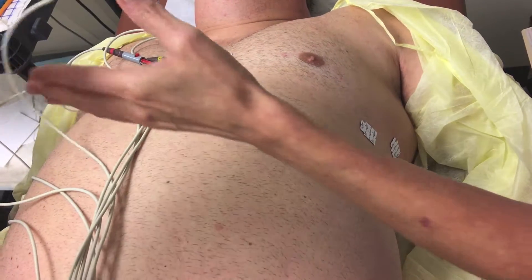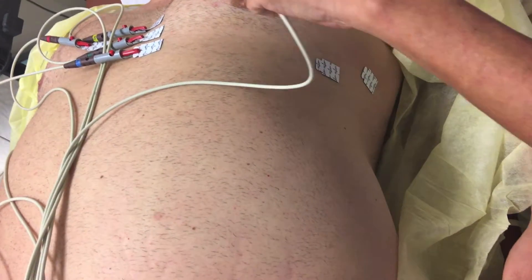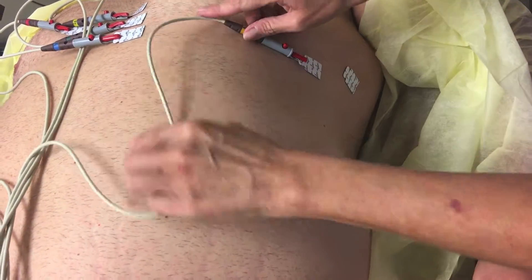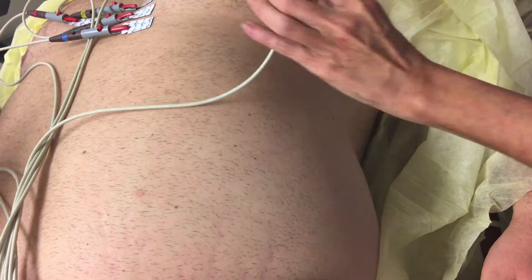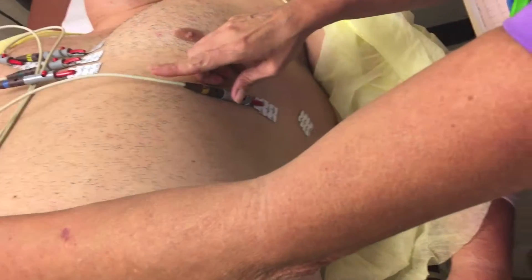I need V5. What if they have metal plates or anything like that? They need to remove all jewelry. You need to make sure that they don't have their cell phone on them — anything that could interfere with the test.